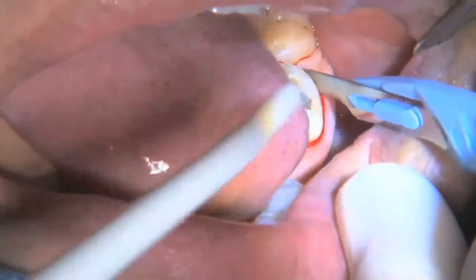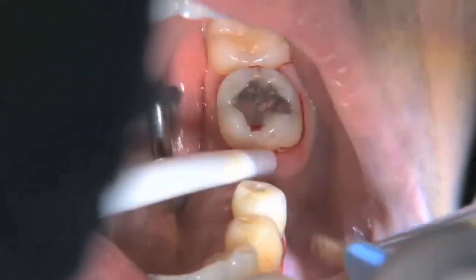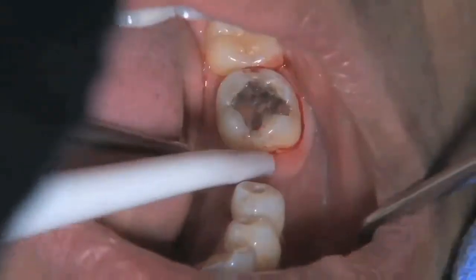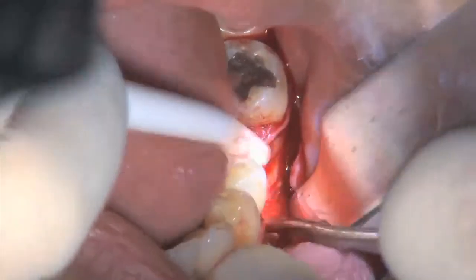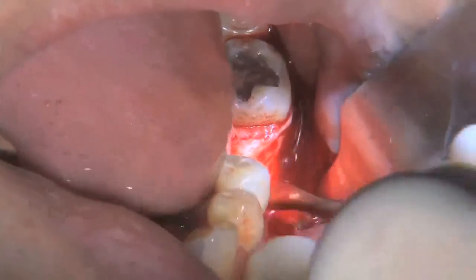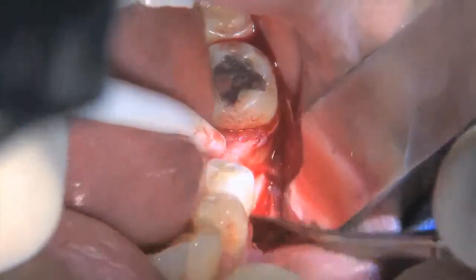In addition to elevating the palatal flap, it is also prudent to, on a limited basis, elevate the lingual portion. It will make the suturing, when the case is complete, much easier than if the lingual tissue is still adhering to the bone. We can now see the deficient area in the labial plate. However, as we noted on the CT scan in our digital treatment planning, this ridge still has adequate width for a 5.0 diameter implant.